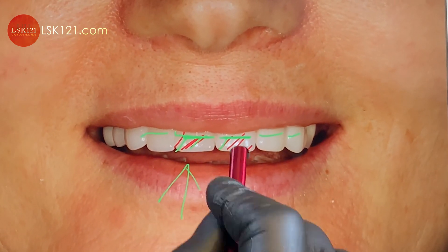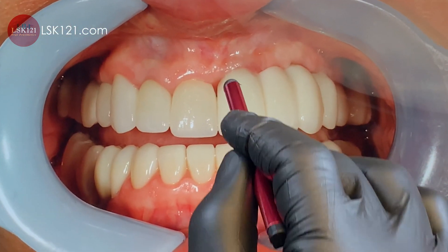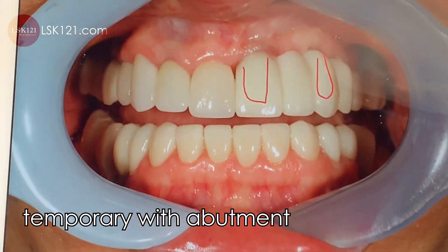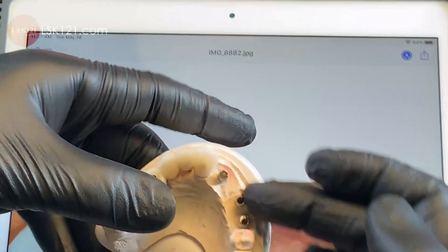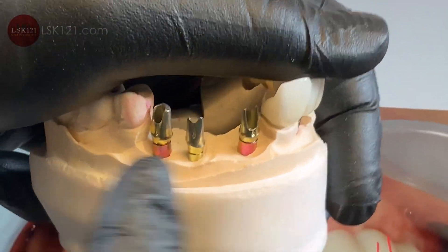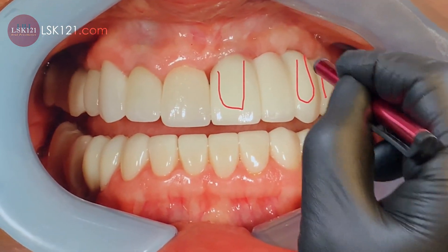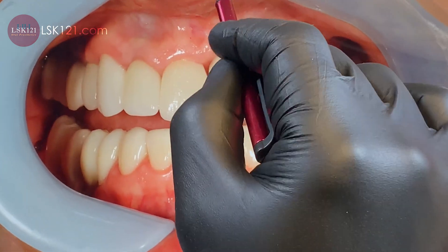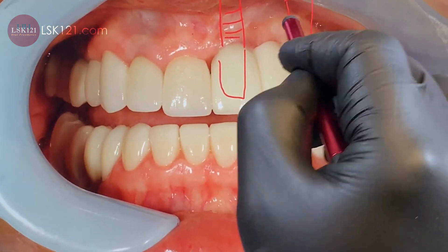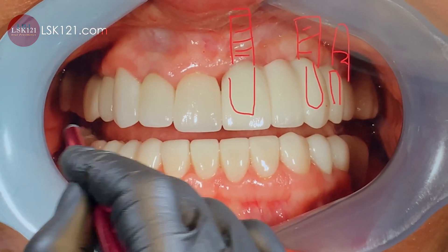Now this temporary — we put it back with the abutment. We made the abutment with gold anodized, positions one, two, three. The patient has implant sites here, here, and here. Horizontally it looks good, midline is good.